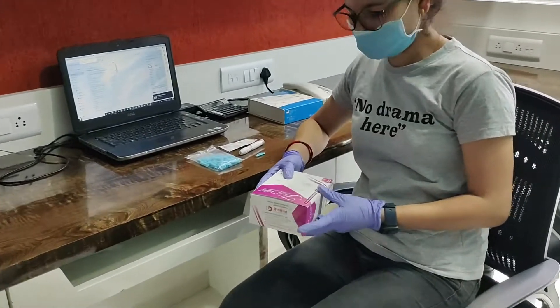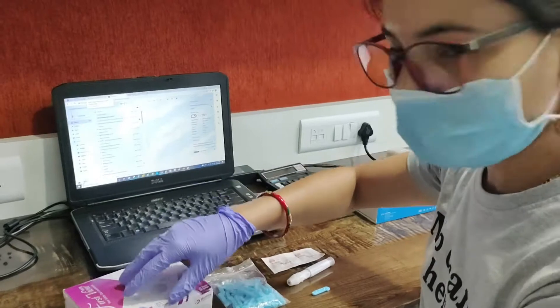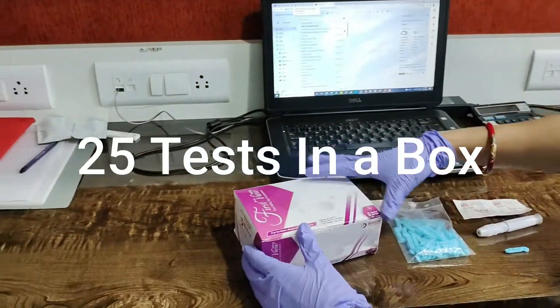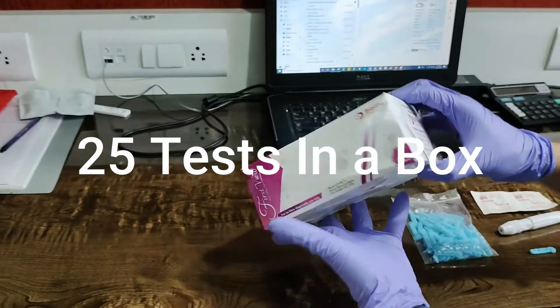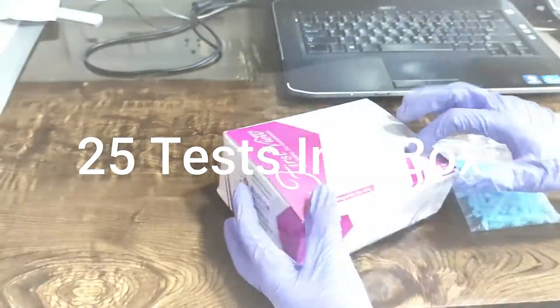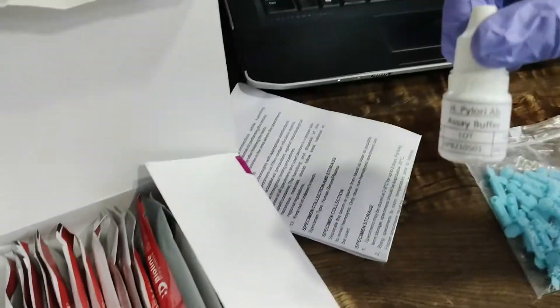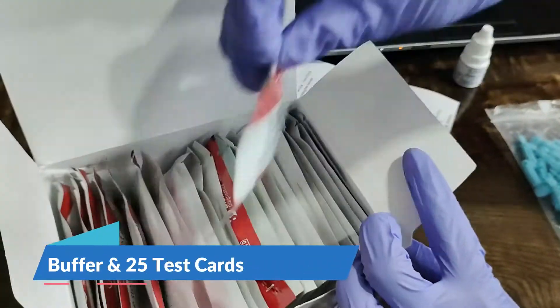Hello friends, today we are going to show you a rapid test kit for H. pylori. Now we are going to open the box, which contains a processor manual, buffer, and the test.